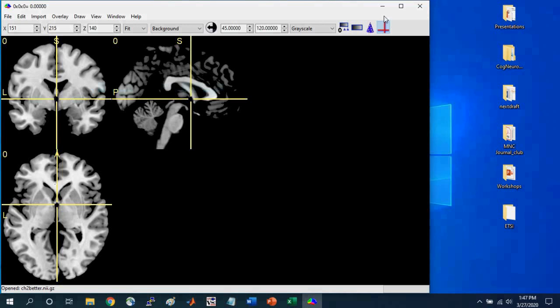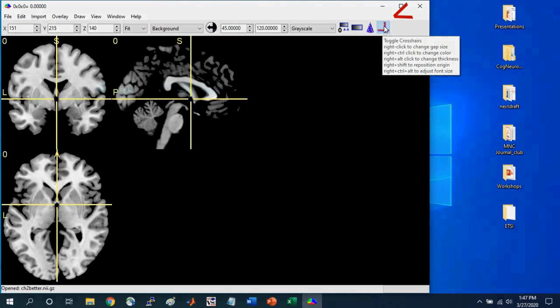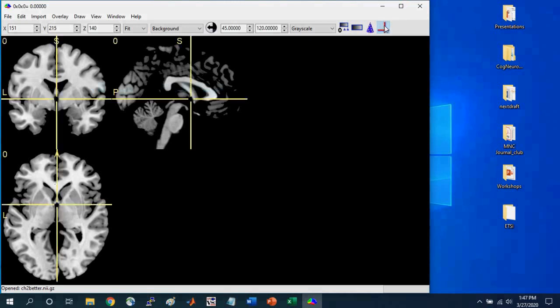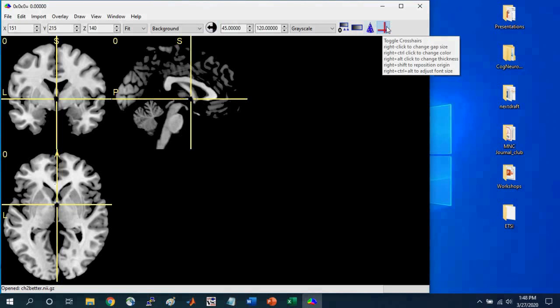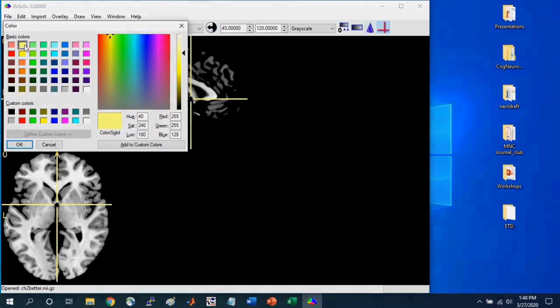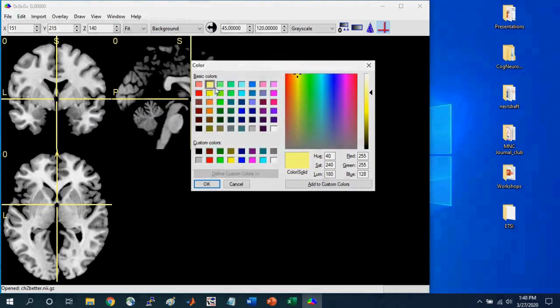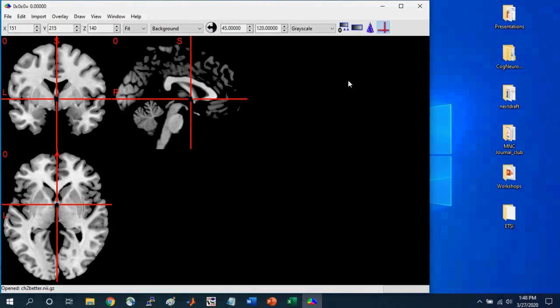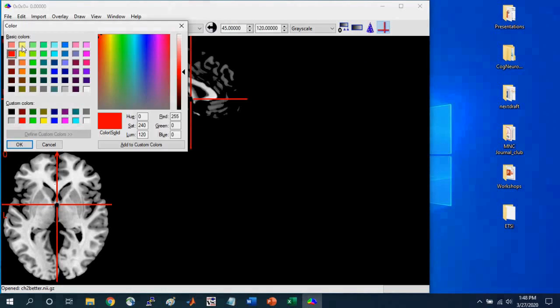You might want to change some parameters for better viewing. You can hover over this symbol here. If you left-click, you can toggle away or toggle back the crosshair that you see here. Wherever this crosshair is, that is where the brain is centered on a specific voxel. If you hover over it again, you can control-right-click and change the color of these crosshairs. Let's say you wanted to set it to red — you can do that. Right-click if you want to change it back to yellow. I find yellow works well over the black background.